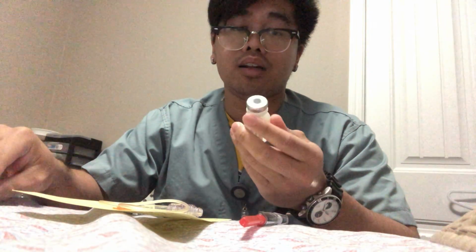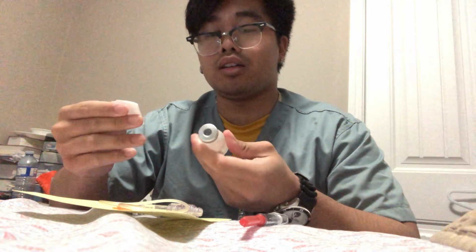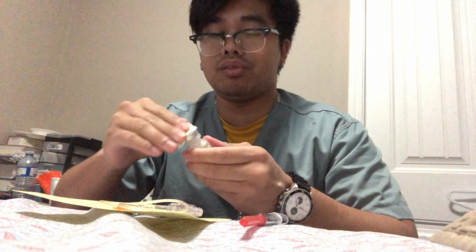Now that I've done that, we have here our normal saline. So first off, before I even extract some contents here, I'd have to apply alcohol swab on the top where the injection's gonna go. Once I've done that, I'm gonna open my 1 milliliter syringe.